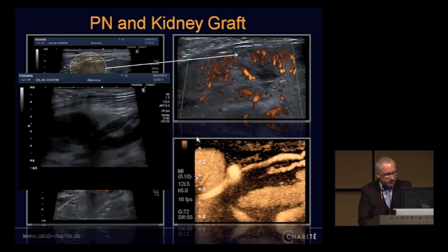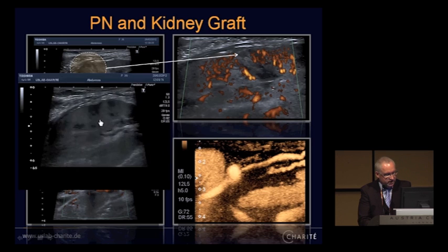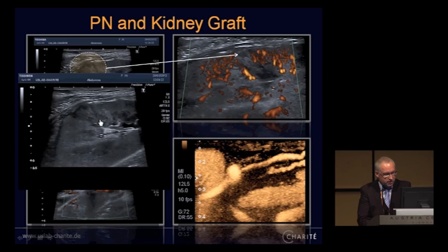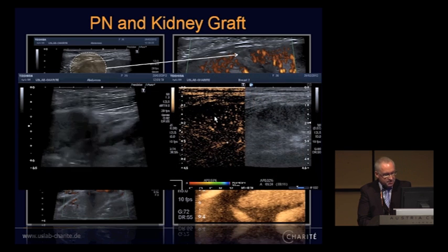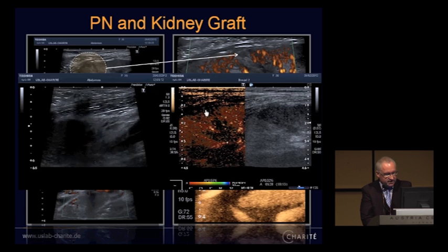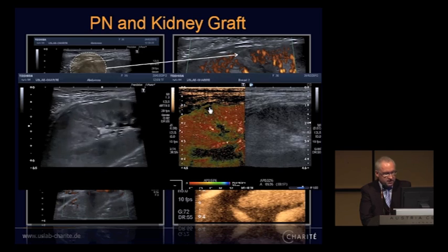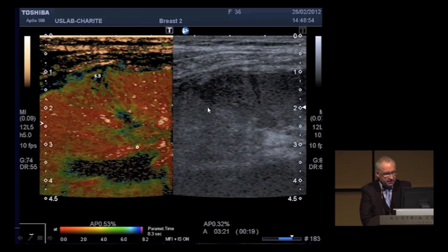We see very beautifully here the ureter, then we skipped over the renal cortex, and we see a very inhomogeneous cortex, and this small nodule here, and that's the perfusion of the small nodule in the arrival time parametric map. And we see there's a delayed enhancement and an absence of vascularity here in that case, and also an effect on the capsule of this renal graft. And this is only visible with this new technology. And so we can say it takes 6.9 seconds to have contrast in this small nodule here. This is a small abscess in a kidney graft.